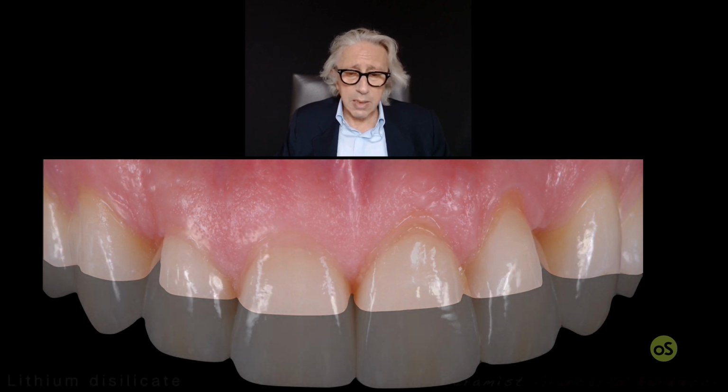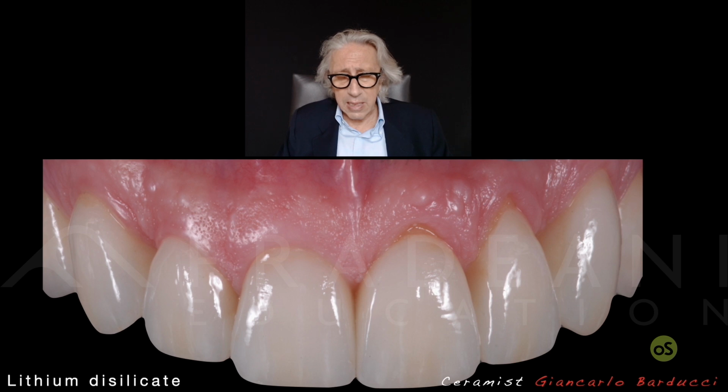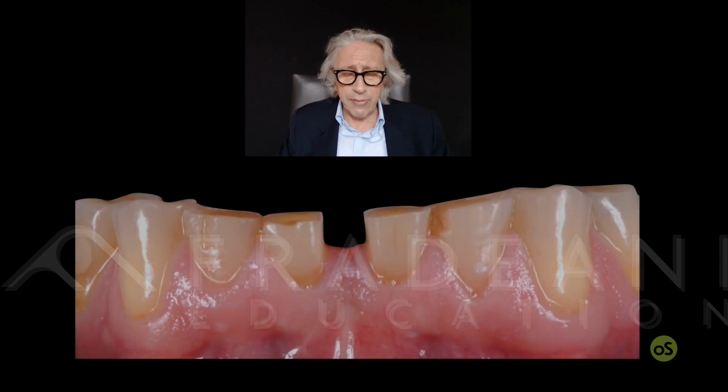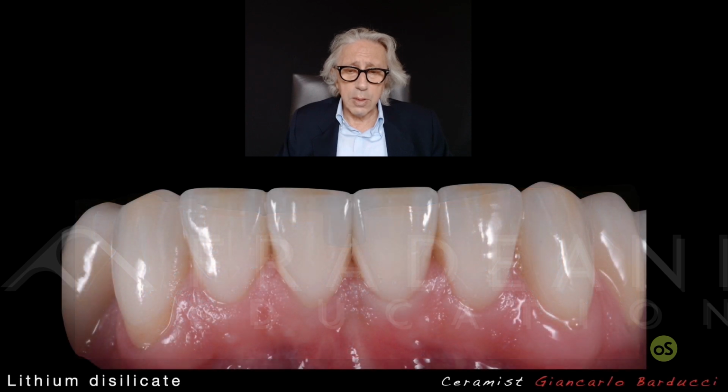Of course, it can be risky, but you have to check the occlusion properly, and you have the chance probably to keep it and achieve a good result. At least we have no long-term result yet in this case. You have short, medium term, up to 5 years. And I show you 5 years after. I said before, Giancarlo is great at moving and changing the contour and the position of the teeth. Look, in this case, it was very complicated, but he did a great job. And that is the final outcome.